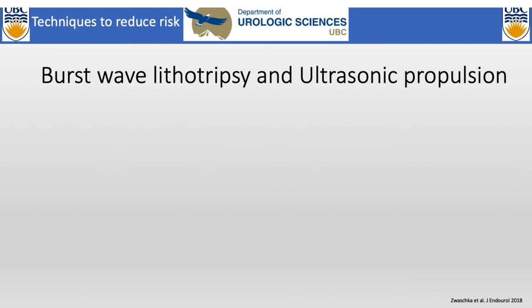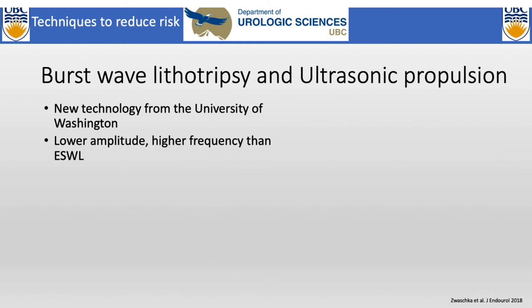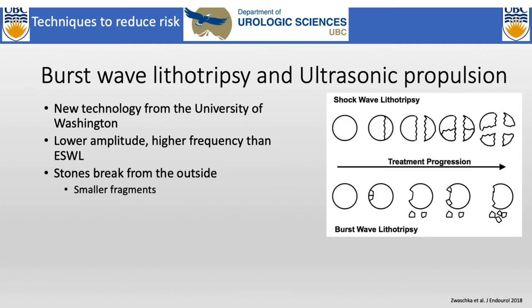Another new technology coming out: there's been a decline in shockwave lithotripsy, so people are looking at any way possible to increase the efficacy of shockwave. And so researchers out of University of Washington have come up with burst wave lithotripsy. Burst wave lithotripsy is lower amplitude, higher frequency than SWL. So it's not quite the big, heavy shocks. It's rather just trying to fragment and stress the stone and break it from the outside. There's a picture on the right suggesting how it's supposed to work.